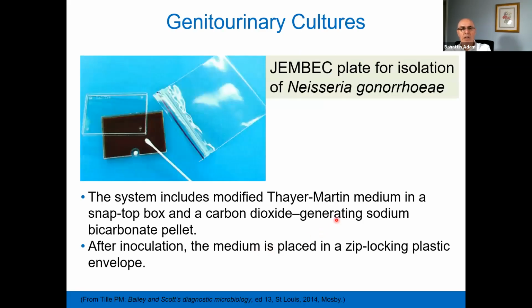Now, as you see here, the JEMBEC plate for isolation of Neisseria gonorrhoeae, the most common urinary infection.